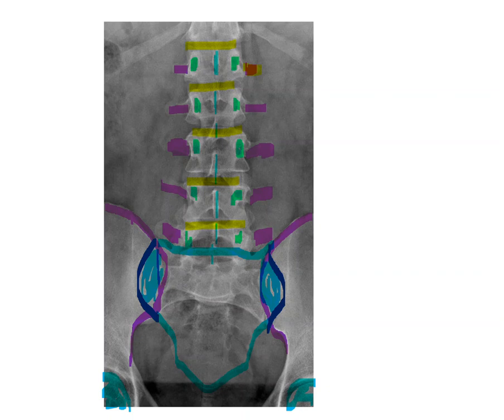So once again, AP lumbar spine, patient is flat on the table, knees slightly bent, the hips are tucked to place the spine parallel to the table. This is demonstrated by open intervertebral disc spaces. Patient is flat on the table, straight with no rotation, demonstrated by symmetry of the transverse processes, symmetry of the pedicles, spinous processes centered down the center of the vertebral body. Symmetry of the right and left SI joints, symmetry of the right and left ala of the sacrum and the right and left ala of the ilium. Also symmetry of the right and left femoral heads.